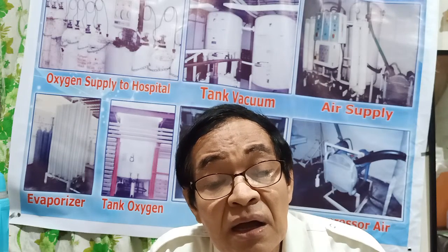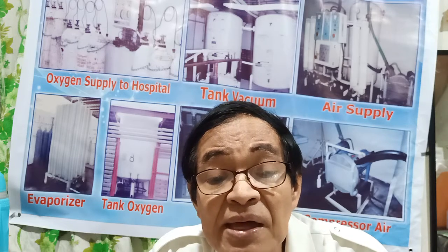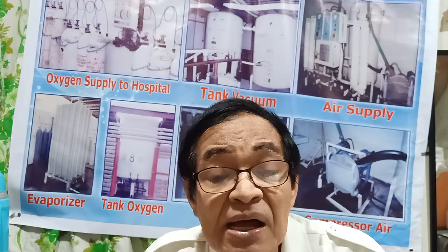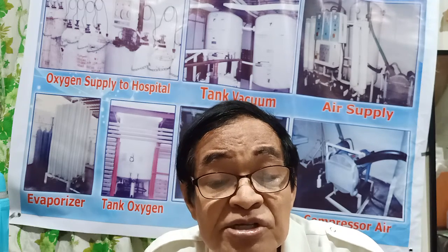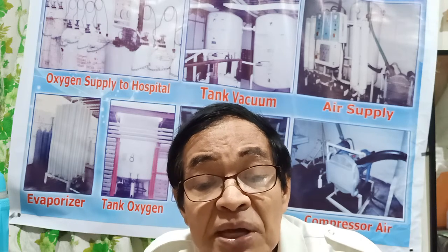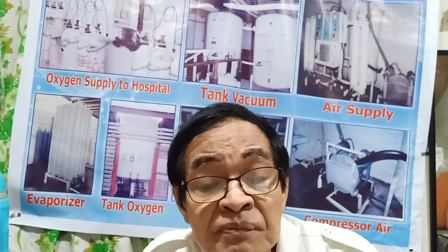Then the connection of medical gases are piped in type K copper piping from the line of the medical gas services unit, the ZSU, to a medical gas terminal unit at the point of use.